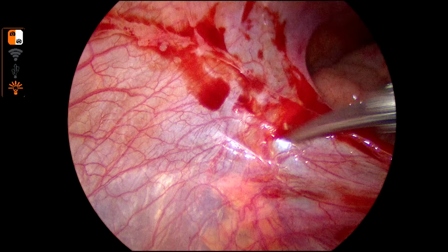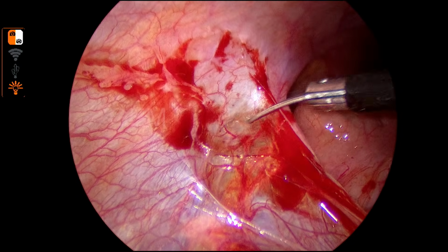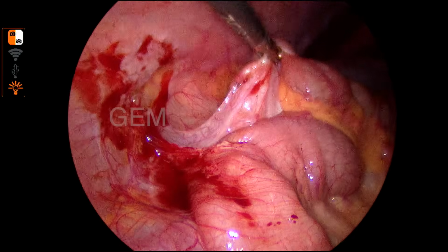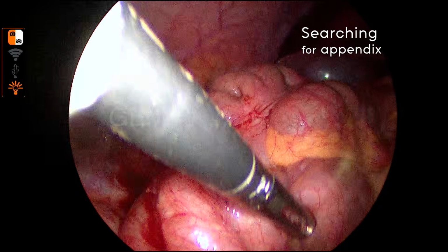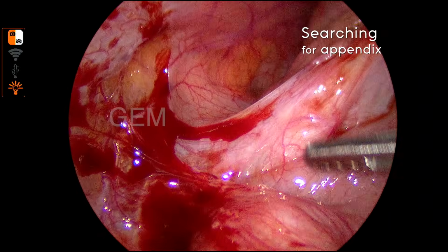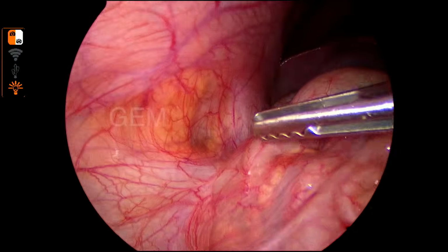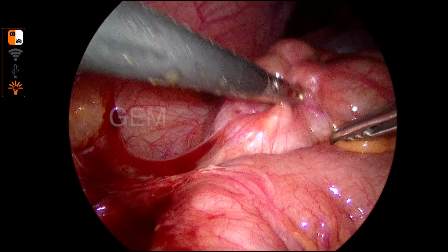In this case, the clinical appendicitis scan shows an edematous appendix, but they are not telling the position. It can be identified in ultrasound or CT, but in this case the radiologist did not mention the position. He called me after starting the appendicectomy, and I was in a different surgery. He couldn't see the appendix. He said there is a paracolic area, there is no appendix seen, and retrocecal also could not be seen.